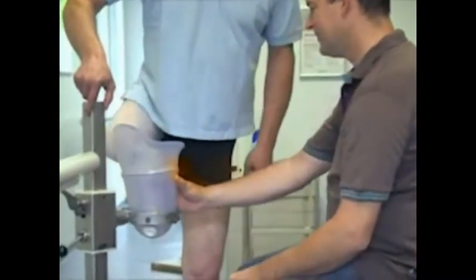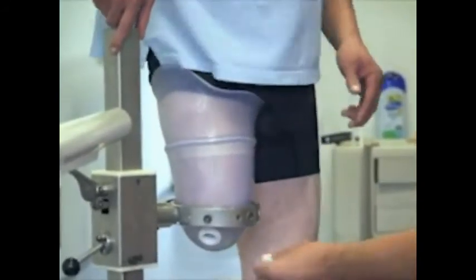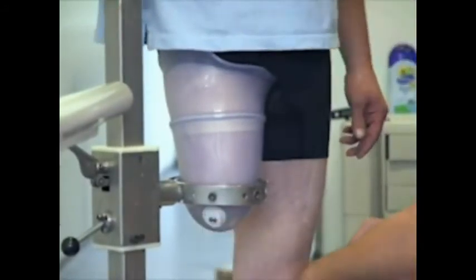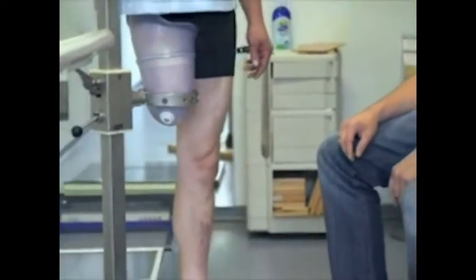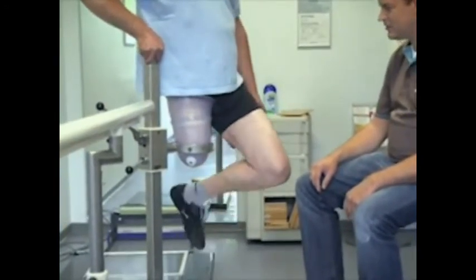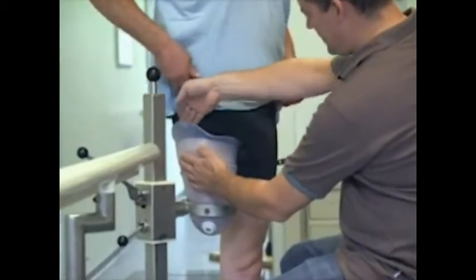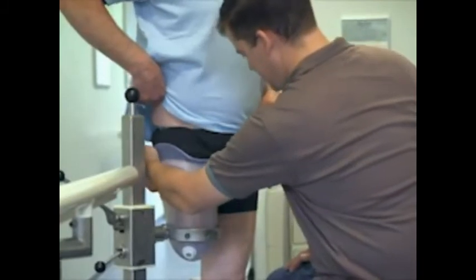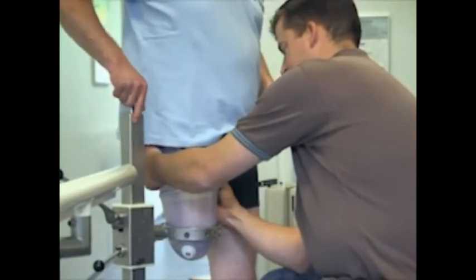The patient can step into the socket without any donning aid. Checking the volume of the socket. Checking the lateral contact surface. Checking the position of the ischial tuberosity and the intersection point.